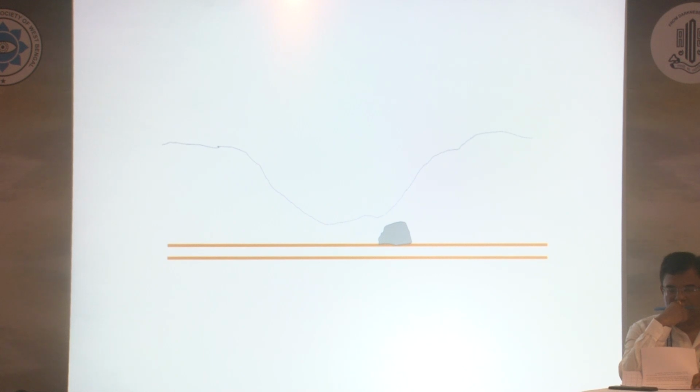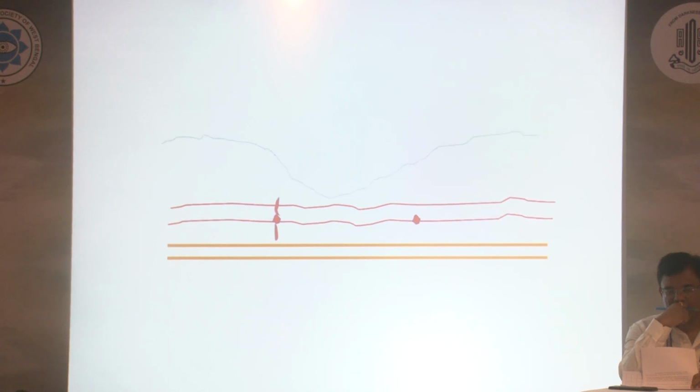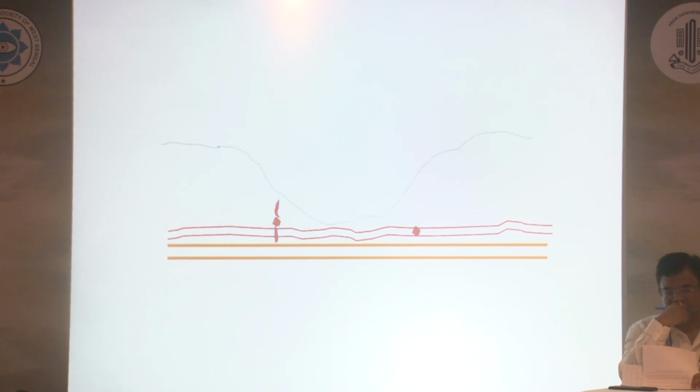But what happens, please look at this at the plexus level. You can see the superficial plexus and the deep plexus. You see the MacTel lesions or the telangiectasia happening. Then you see a retinochoroidal anastomosis going up and down. But at the same time, you see the retinal contour going down and the retina getting flatter, and both the plexus is being pushed to the avascular zone, just above the RPE. This is what you mean by vascular invasion.